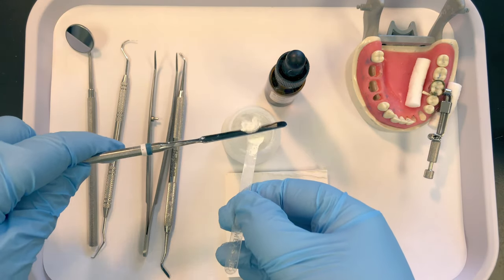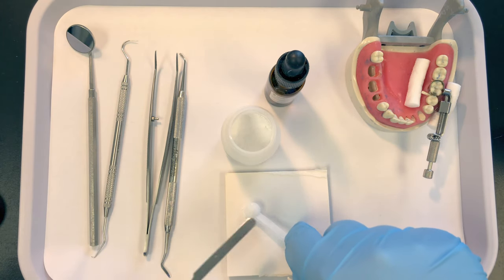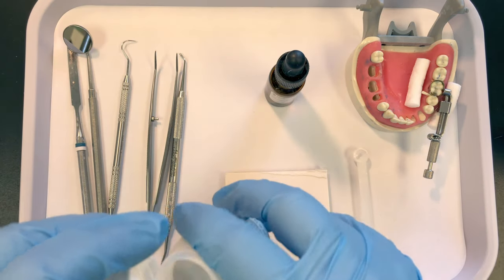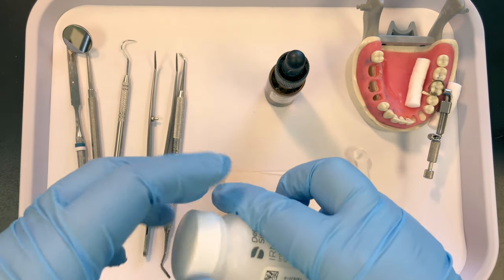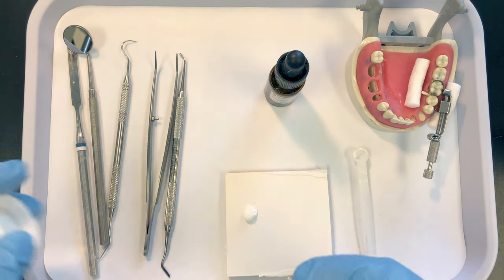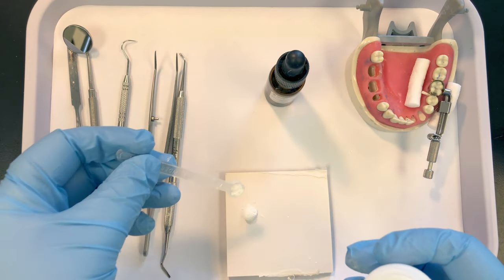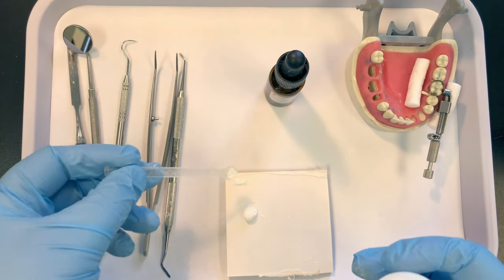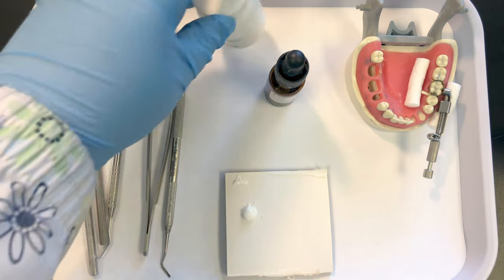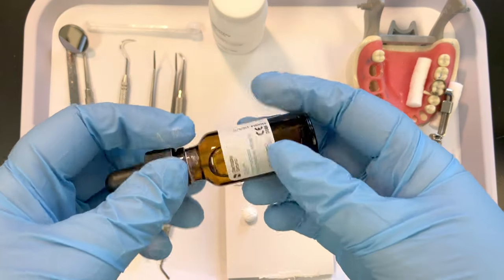Place it on your paper mixing pad. I know a lot of offices just pour some out and mix to the proper consistency, but when you're starting out, use the measurements. I always place a little extra powder out — that'll be handy when it comes time to place the restoration and helps prevent the material from sticking.